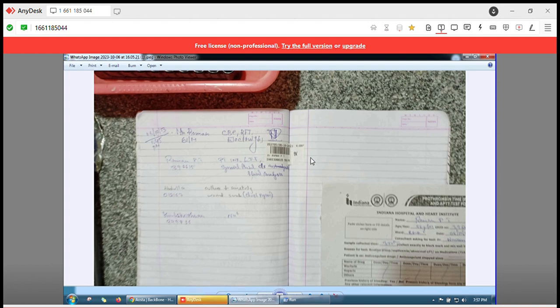Okay, so that means you need to have three things. One, if it is coming from an emergency department where the patient is not registered yet, they have to send you a book. In the book they have to write the patient name, age and the UHID number, and write what the tests are. During that time you have to make sure that you are assigning the date and time. Or you can also generate the manual barcode which is present in our computer. Manually you can enter the patient name, so the date and time automatically come in the barcode, and you can stick it on.